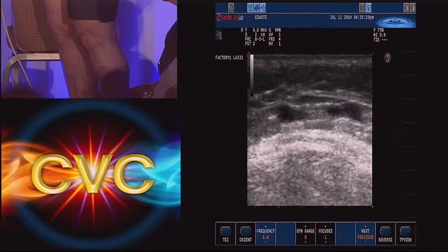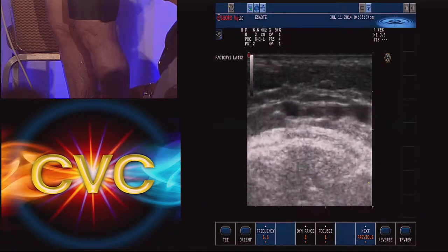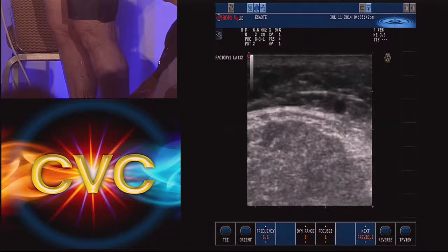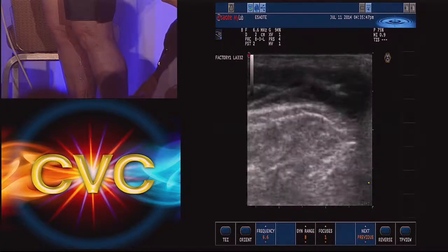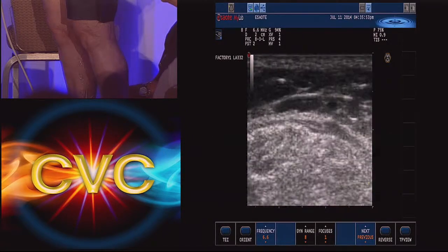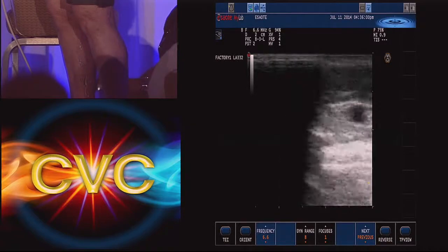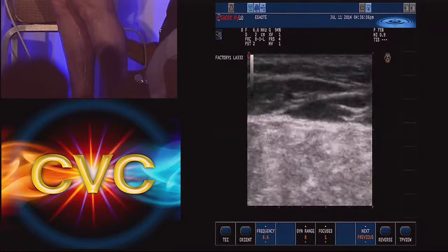Just pause there for a second, please. You see this going across? And then follow the second one down, please. And you'll see that it'll go into a deeper perforator of sorts. Can you go back up and follow it through? There, stop, you just passed it. See that going down? That's the perforator. So it's plumbing and you just follow the pipe. If there's any doubt, you kind of put color and watch it. Patience though, patience is the key. Yes.